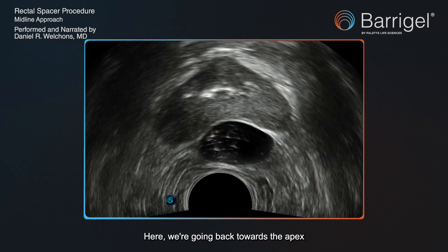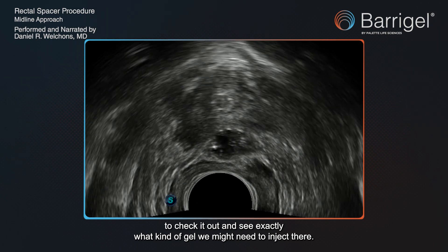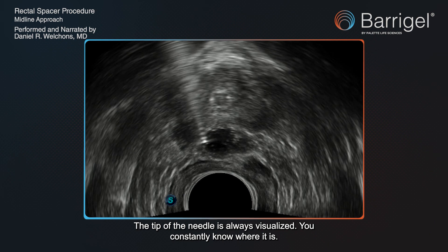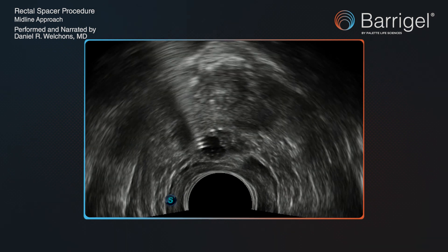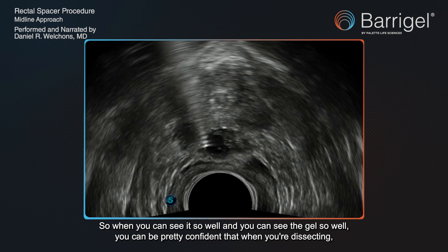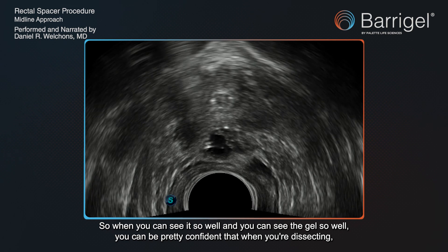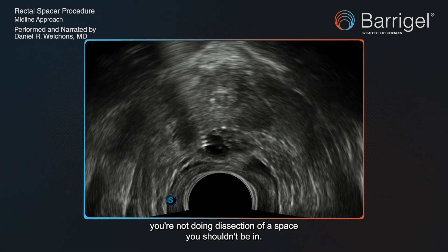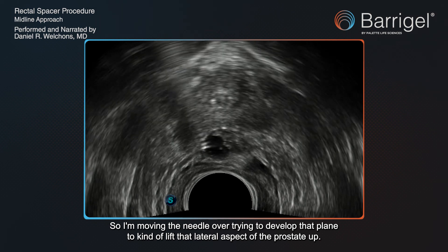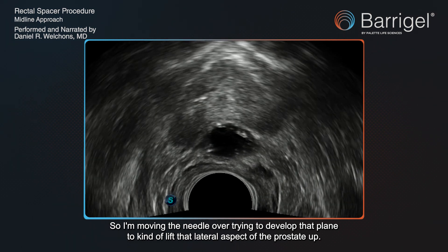Here we're going back towards the apex to check it out and see exactly what kind of gel we might need to inject there. The tip of the needle is always visualized — you constantly know where it is. You know you're being safe, and you can also use the needle to develop the space. When you can see it so well and see the gel so well, you can be confident that when you're dissecting, you're not doing a dissection of a space you shouldn't be in. I'm moving the needle over, trying to develop that plane to lift the lateral aspect of the prostate up.